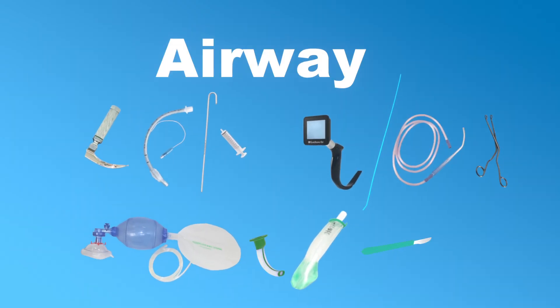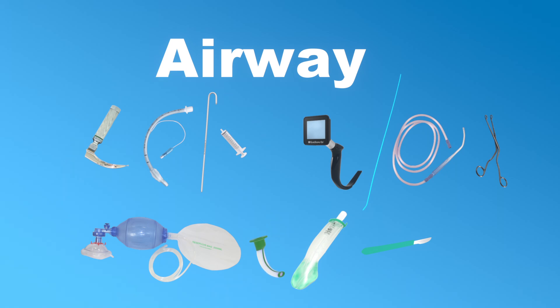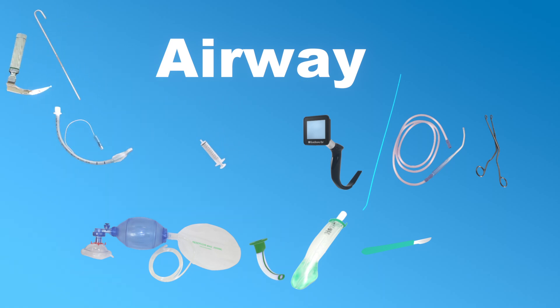Starting with A — the airway — we begin with the essentials for smooth, problem-free intubation. We choose a properly sized blade and check the lamp of the laryngoscope. We open up an endotracheal tube that will fit the patient and prepare it with a stylet. We also need a syringe for the cuff of the tube.